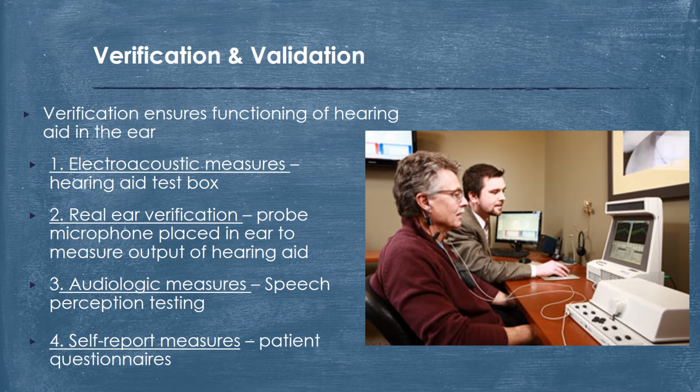So what I want to do is ask them, hey, how are you hearing now that you have your hearing aids? We also want to know other things like how much are you using your hearing aid? How much benefit do you think you're getting? So you can repeat these questionnaires before and after a hearing aid fitting, or you can just do it one time after a hearing aid fitting, based on how the questionnaire is worded.